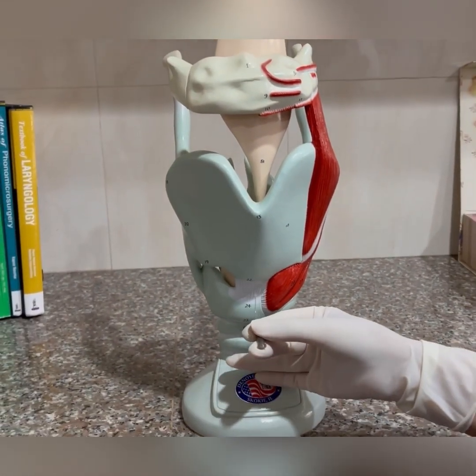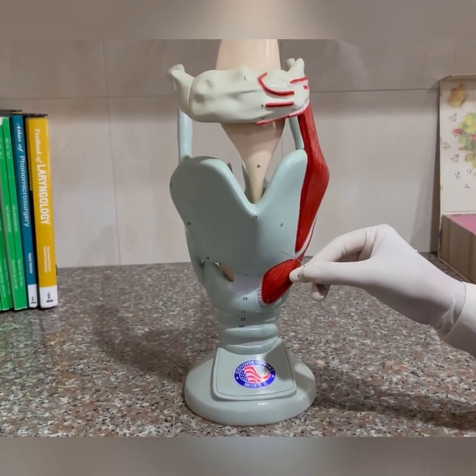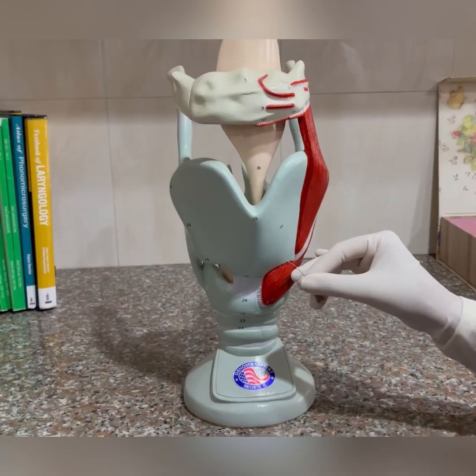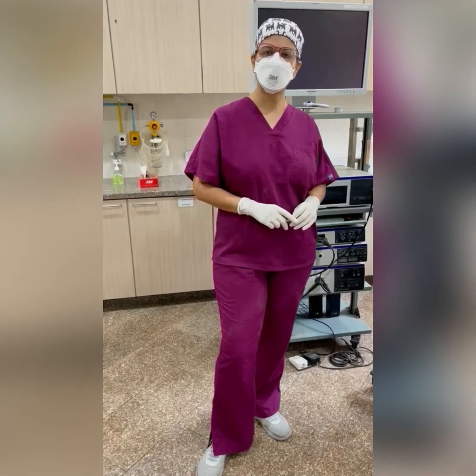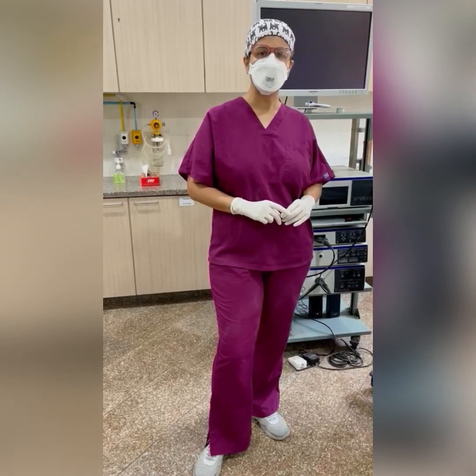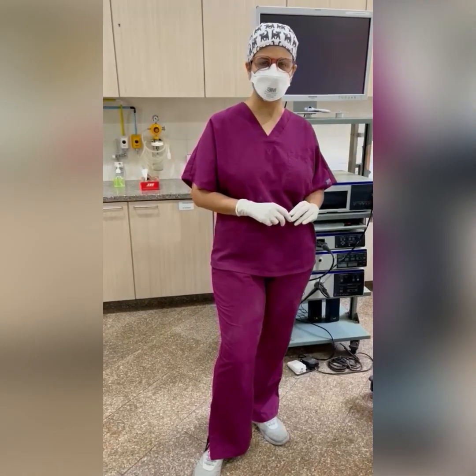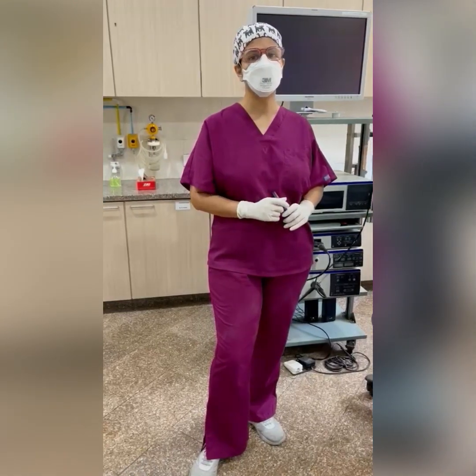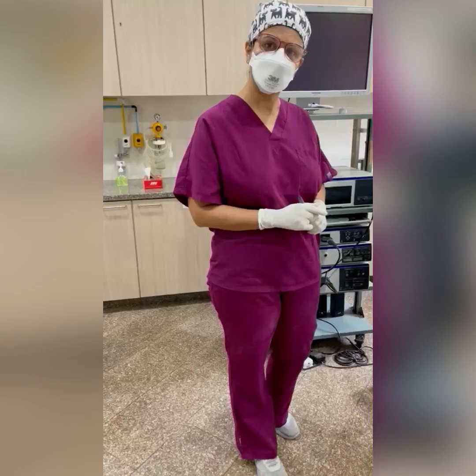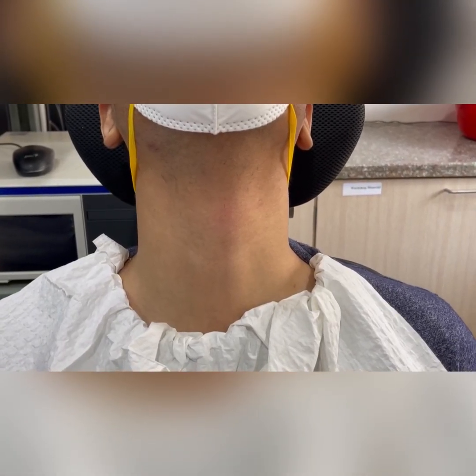With the cricothyroid route you have to be close to the vocal folds, and with the trans-thyroid technique you won't see the needle tip — you just want to see the tenting. For the first few injection laryngoplasty cases you perform, it may be preferable to make surface markings on the patient's neck so that you are exactly comfortable with where the needle should be inserted during the percutaneous injection. Here we have our patient with the neck in a position of extension.